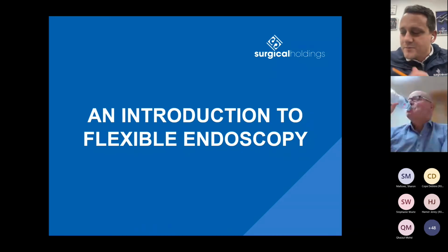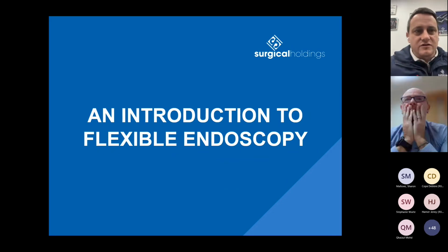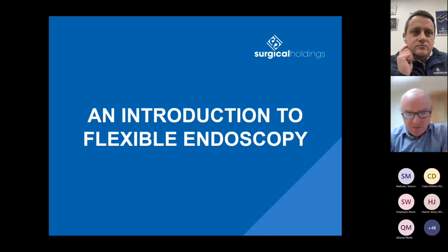Another one from my perspective: robotics, you sort of touched on. Have you seen any robotic solutions that are coming into this field? Well, interestingly, we were both at Medica last week, and there was a paper there that I read about with robotics, and there's no reason why, I guess, with AI developments, you couldn't do a robotic endoscope, but what they were principally talking about was developing with nitinol, a memory alloy, moving through that way. And they were also talking about a single patient use instrument.